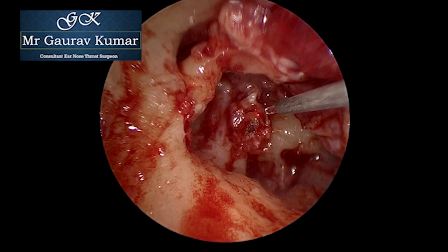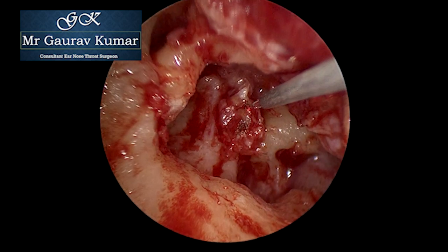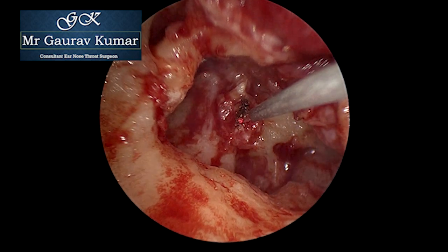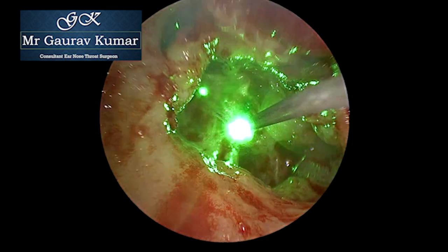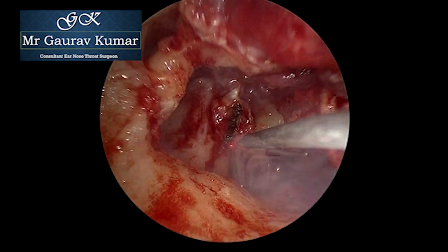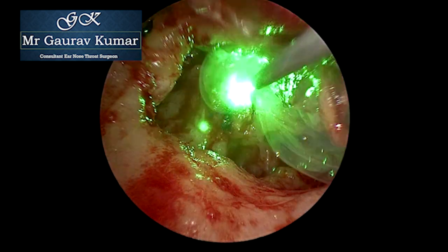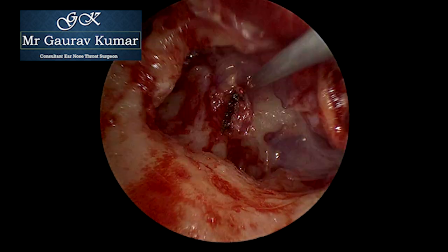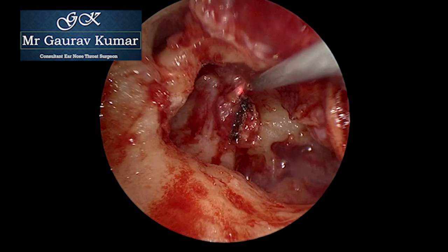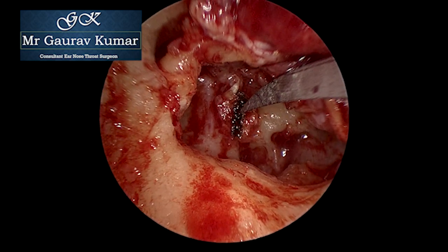Second, finding the plane between the cholesteatoma sac and the ossicles. In this particular case, as there were no planes identified, I decided to use KTP laser to create a plane right in the middle. You can see the facial nerve along the horizontal segment. KTP laser was used with single pulse, one volt, to have better control over the lasered area.